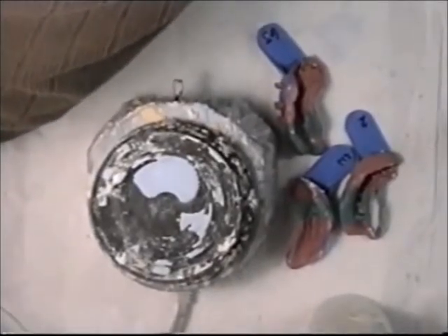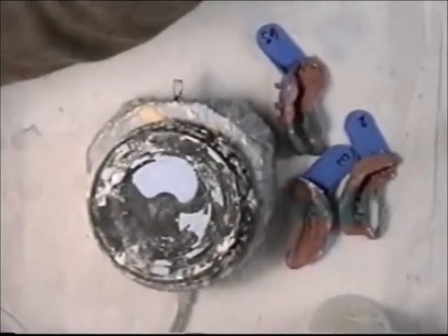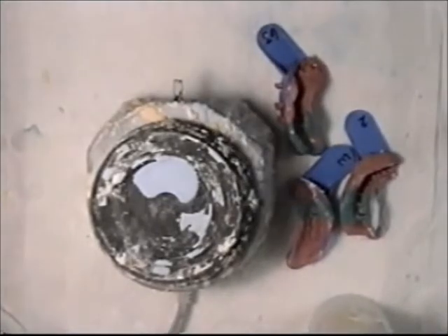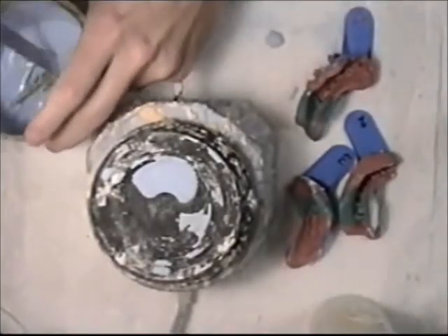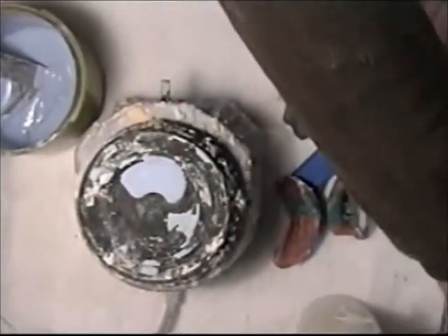I'm just connecting it to my mixing machine. I'm not going to be able to illustrate this, but I will get right back when I start to pour my impressions up. I've mixed up the stone — I mixed it up for about 40 seconds.